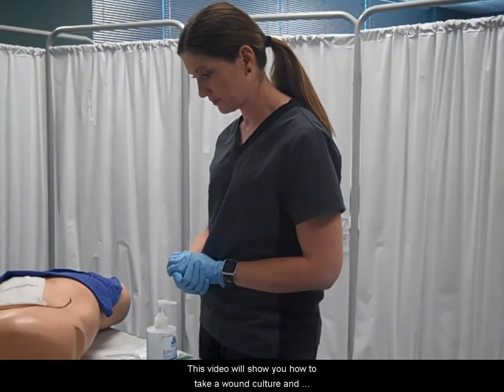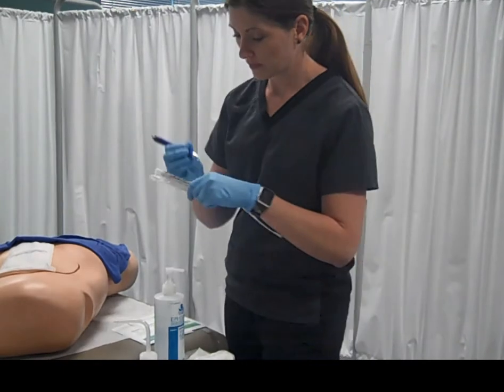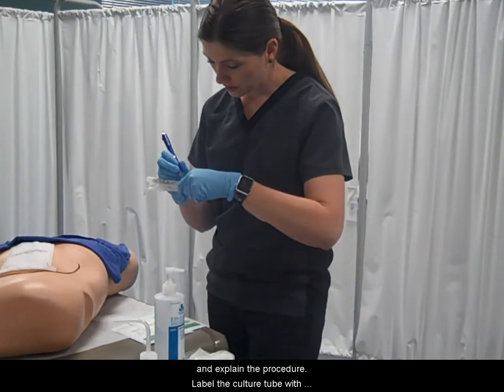This video will show you how to take a wound culture and irrigate a wound. After you have performed hand hygiene and put on gloves, warmly greet and identify the patient, introduce yourself, and explain the procedure.